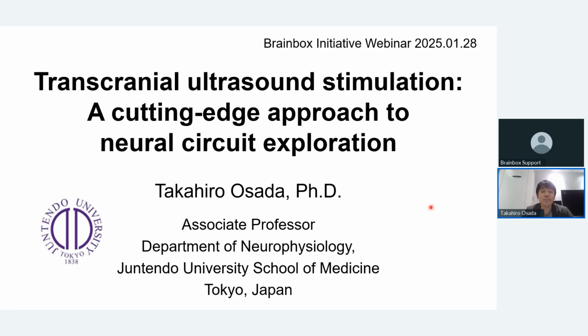In my presentation, I will talk about transcranial ultrasound stimulation, TUS, a new non-invasive brain stimulation technique. This technique is capable of stimulating both cortical surface and deep brain structures.